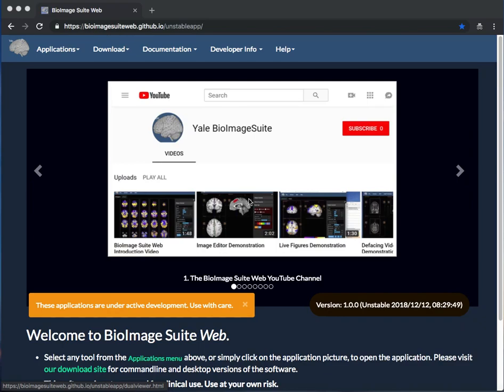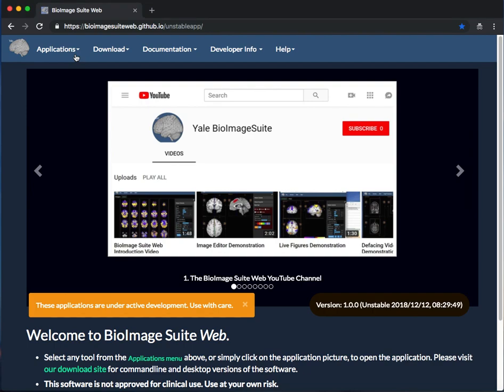This video will introduce you to the BioImage Suite Web Connectivity Viewer, which lets you create visualizations of connections between brain regions.